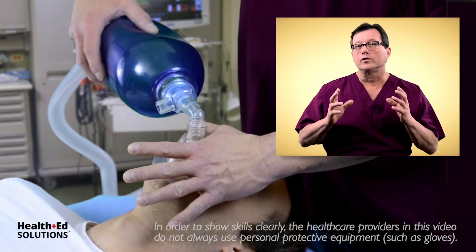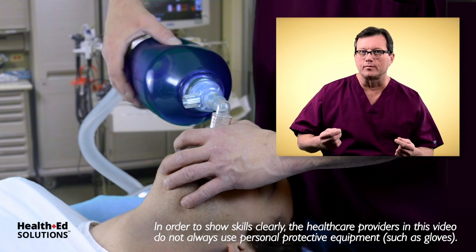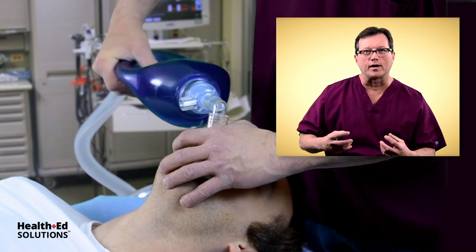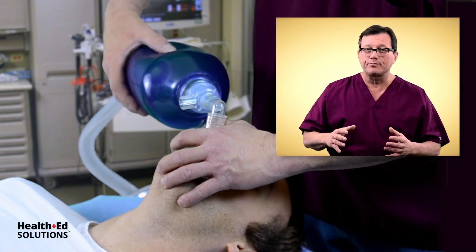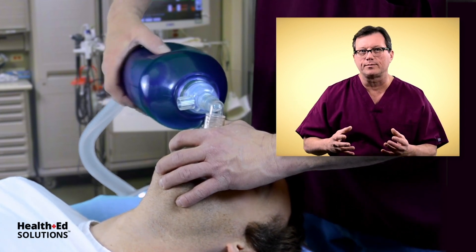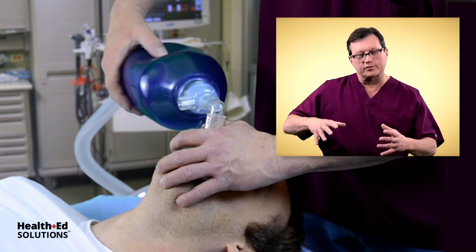Here's a helpful tip when you're performing bag valve mask ventilations on a patient who may still be breathing, but is not breathing either often enough or deep enough, and we still need to provide supplemental breaths. If you look in the video, I have some slight pressure on the ambu bag with my thumb. By keeping that slight pressure, I can feel when the patient is about to take a breath, and then I can support that breath. After each breath, I'm keeping slight pressure on the ambu bag — I'm not trying to provide PEEP, not trying to provide positive end expiratory pressure. I'm just keeping a little pressure so I can feel when the patient takes a breath and support it. If they don't take a breath in five to six seconds, I can provide them a breath.